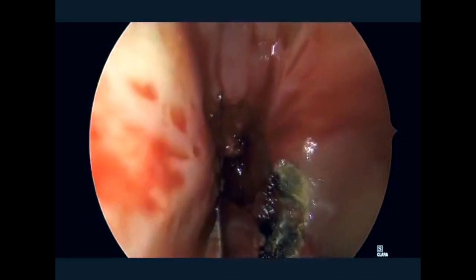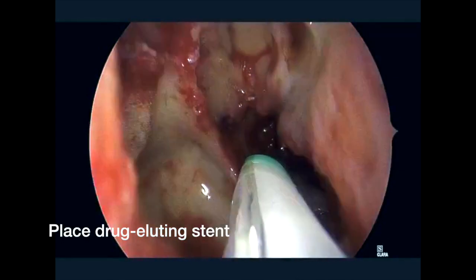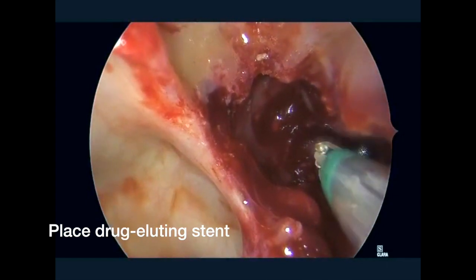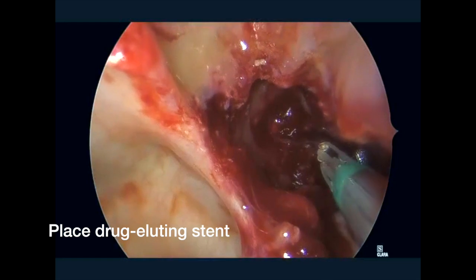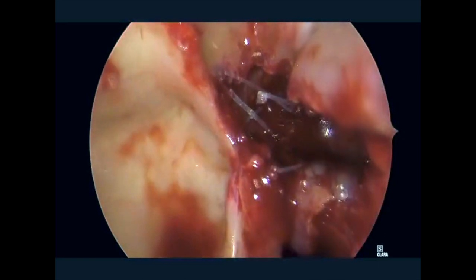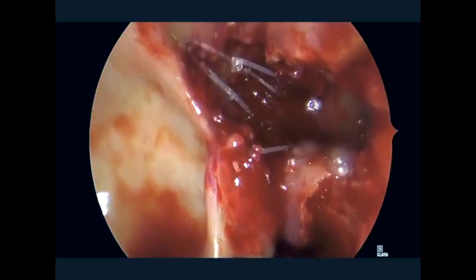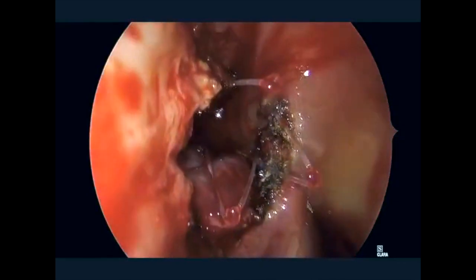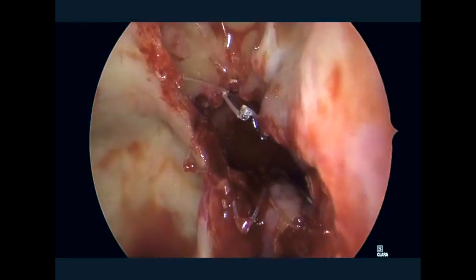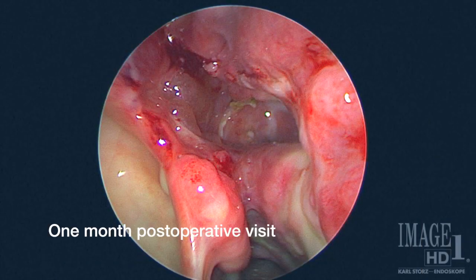Once we're satisfied with the placement and coverage, we place Propel stents to help keep the flap in place and deliver mometasone and steroid to the area to ensure good healing postoperatively. These drug-eluting stents are helpful both from a positioning standpoint and for steroid delivery. It's important not to place these deep within the sphenoid, and if there's an exposed carotid or optic nerve, one would exercise more caution. It's important to note any dehiscence.